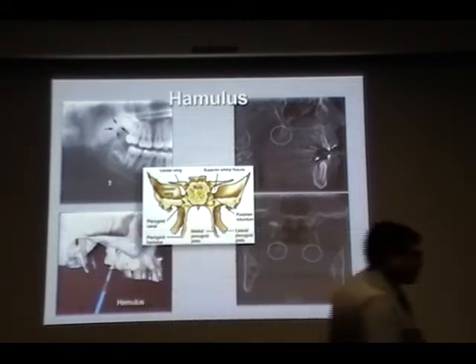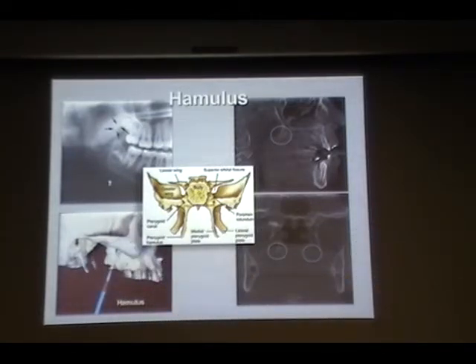Okay, so there are two, medial and lateral pterygoid plates. Which slice is this one? Coronal slice. Again, this is the vomer bone, this is the sphenoid sinus, medial pterygoid plate, lateral pterygoid plate. Okay, so the condyle or the ramus is sitting in this sling, and half of the sling is the hamulus, and then the other half is what?